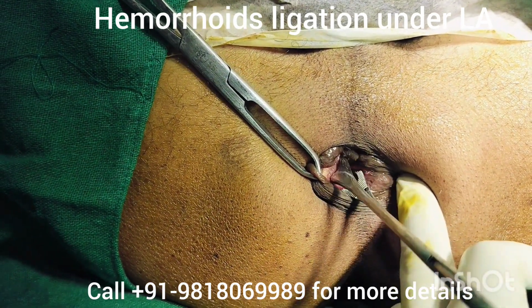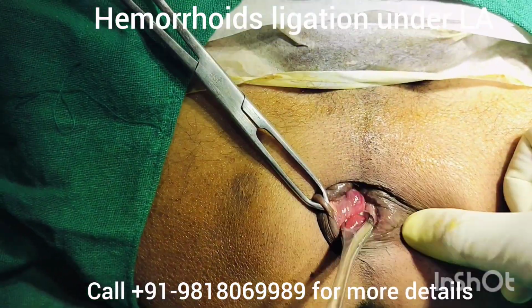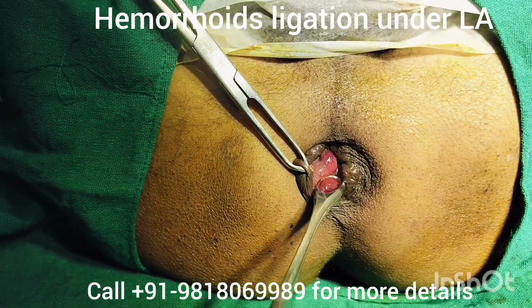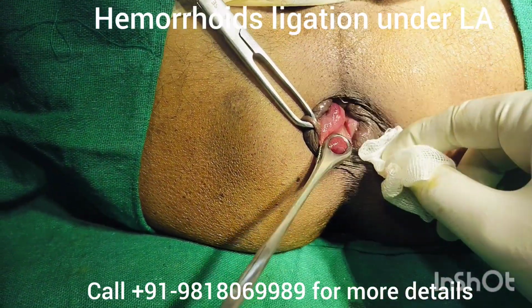Allis forceps have been applied at 7 o'clock position, and we have held this 7 o'clock pile mass using piles clamps, and we will ligate it now.